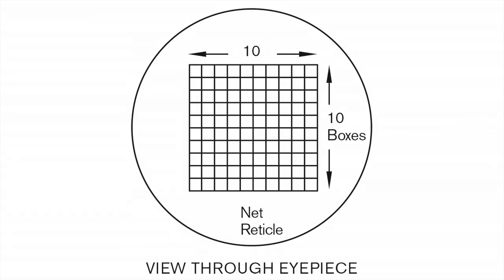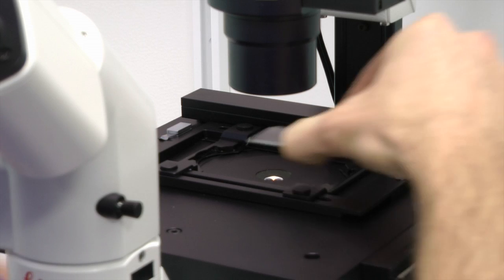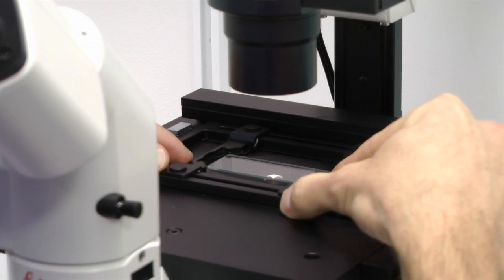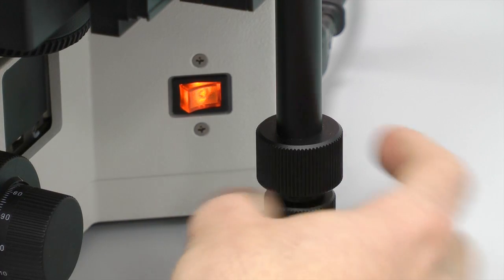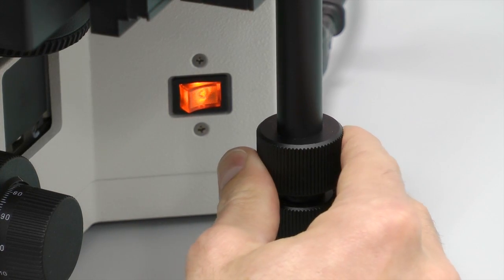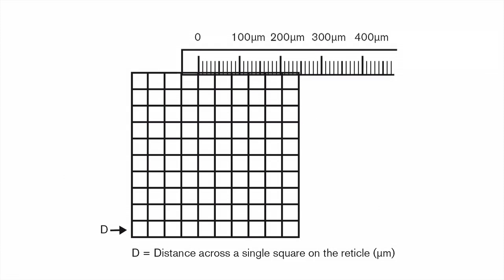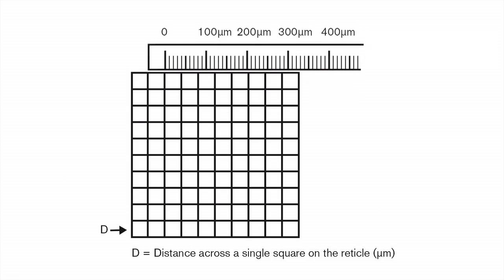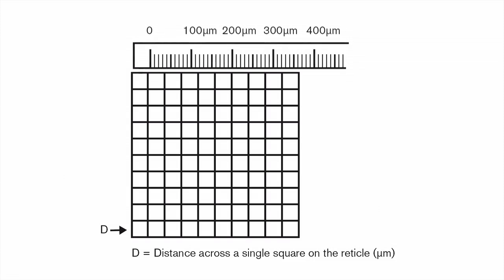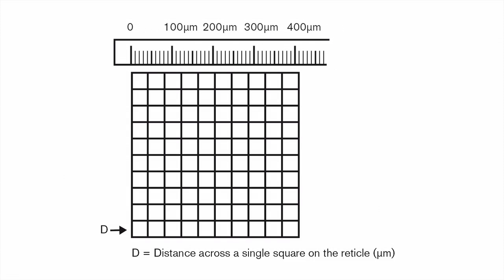This is your view through the eyepiece. The next step is to make a calibration — in other words, to determine the sizes of the boxes in the grid. Place the stage micrometer on the microscope stage and line it up so that one of the large lines is to the left edge of the reticle matrix. Measure the distance across all 10 boxes of the reticle and divide that number by 10 to get the value of d, the distance across a single box.